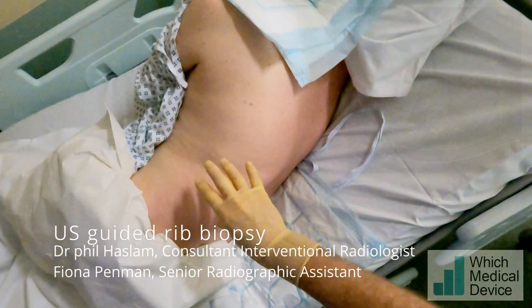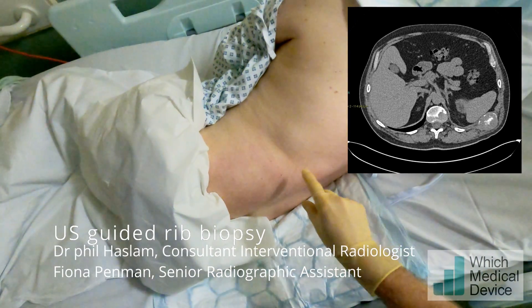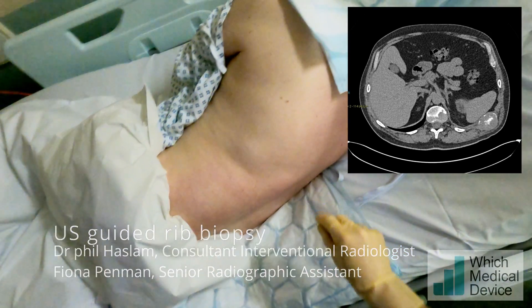So this gentleman has got a mass in his left rib and what we're going to do is an ultrasound-guided biopsy just along this point here to find out what this is and give it a tissue diagnosis.